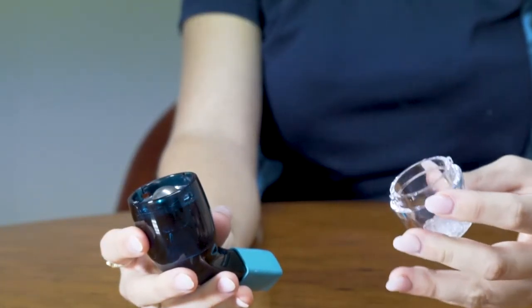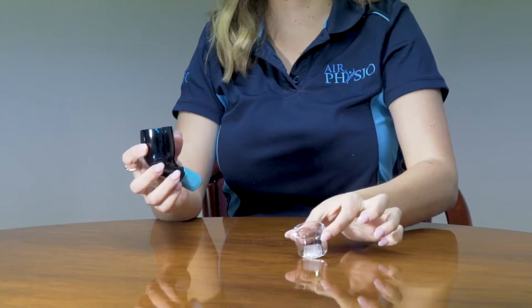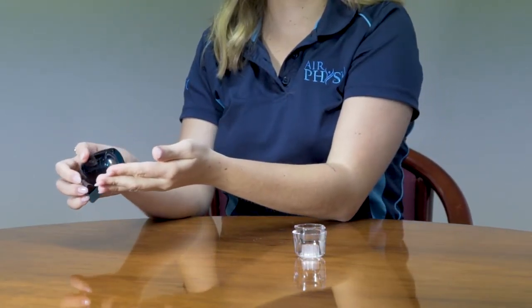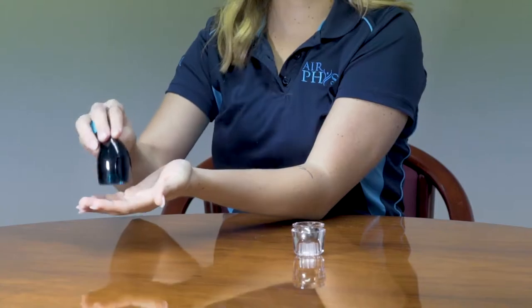Disassembling the Air Physio device. Once you've removed the cap, pull the stainless steel ball bearing from the device and place it in the upside down cap. Tap it two to three times on your hand or on the table to remove the cone.